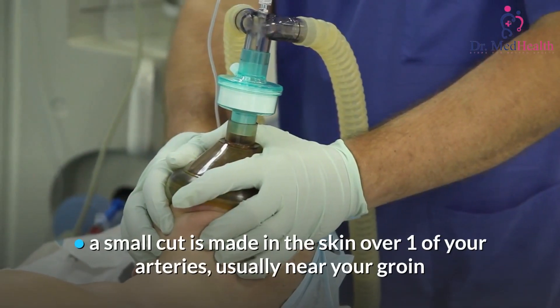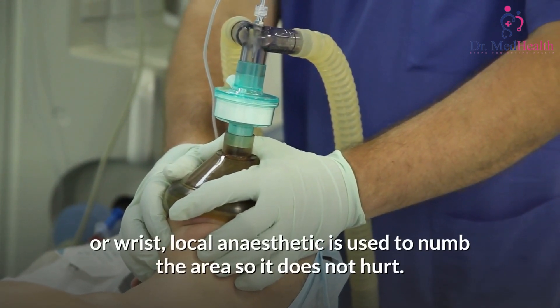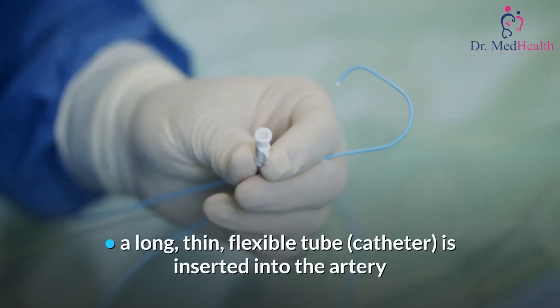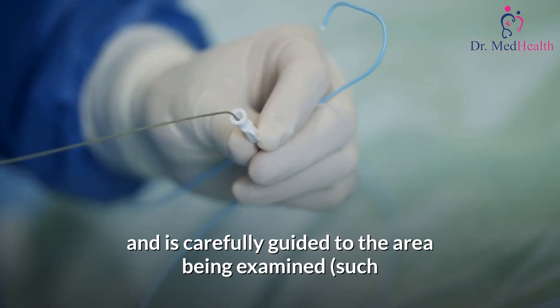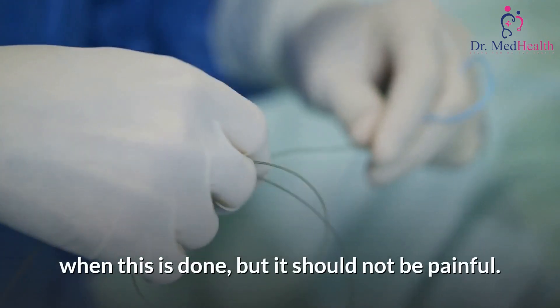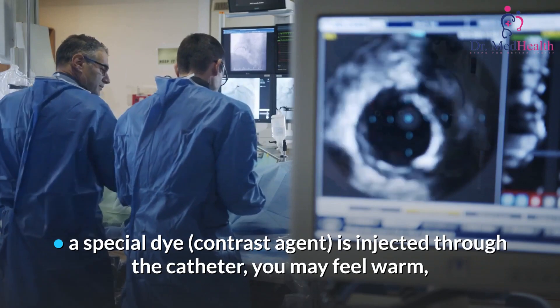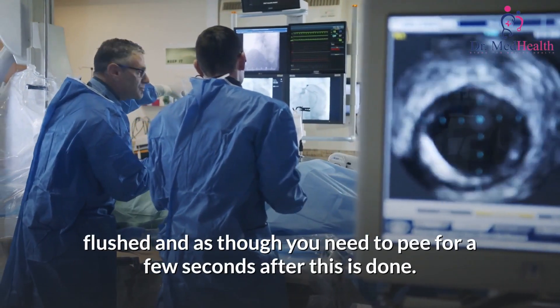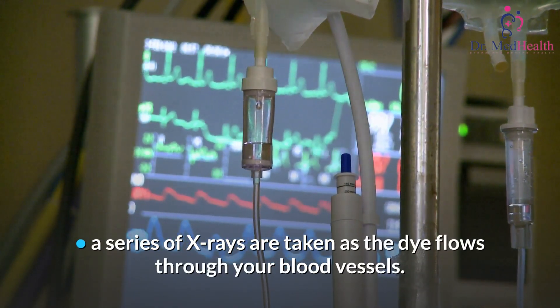A small cut is made in the skin over one of your arteries, usually near your groin or wrist. Local anaesthetic is used to numb the area so it does not hurt. A long, thin, flexible tube called a catheter is inserted into the artery and carefully guided to the area being examined, such as the heart. You may feel some pushing and pulling, but it should not be painful. A special dye — contrast agent — is then injected through the catheter, and you may feel warm, flushed, and as though you need to pee for a few seconds.